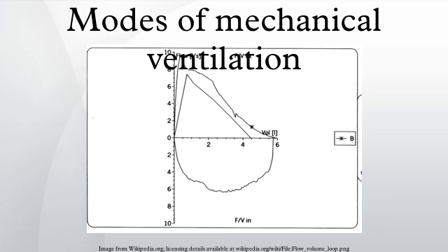Modes of mechanical ventilation are one of the most important aspects of the usage of mechanical ventilation. The mode refers to the method of inspiratory support. In general, mode selection is based on clinician familiarity and institutional preferences, since there is a paucity of evidence indicating that the mode affects clinical outcome. The most frequently used forms of volume-limited mechanical ventilation are intermittent mandatory ventilation and controlled mechanical ventilation.